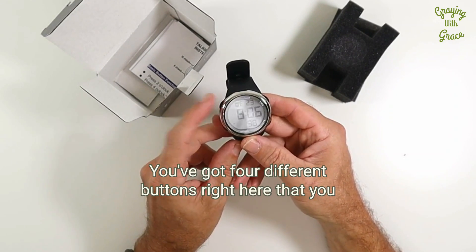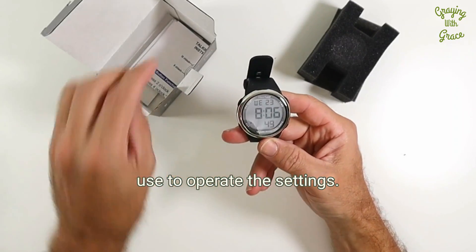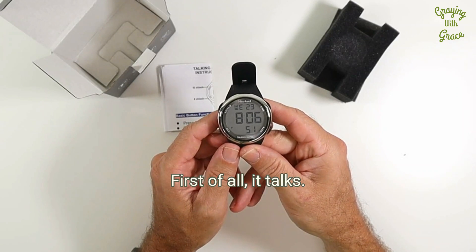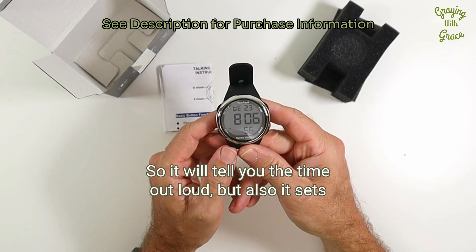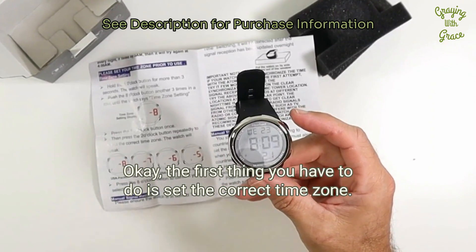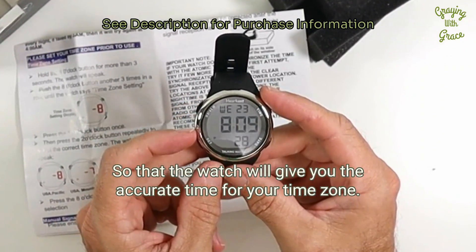It is a talking watch. You've got four different buttons right here that you use to operate the settings. This watch has a couple of different things — first of all, it talks, so it will tell you the time out loud, but also it sets itself using the atomic clock. The first thing you have to do is set the correct time zone so that the watch will give you the accurate time for your time zone.